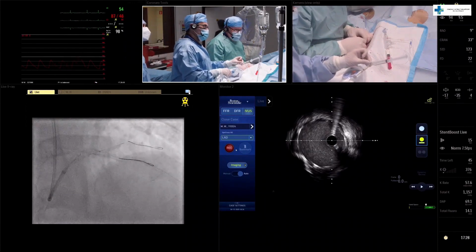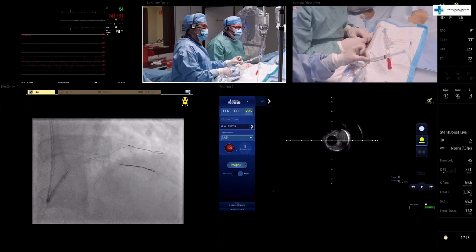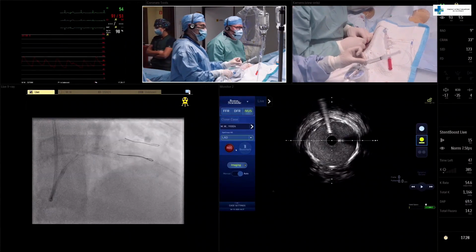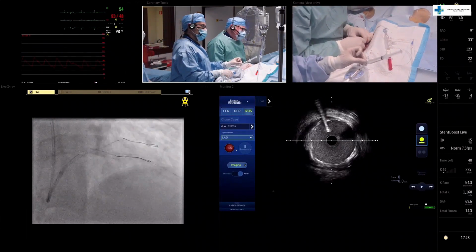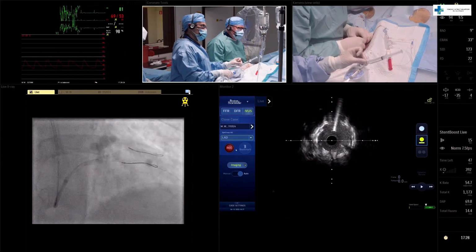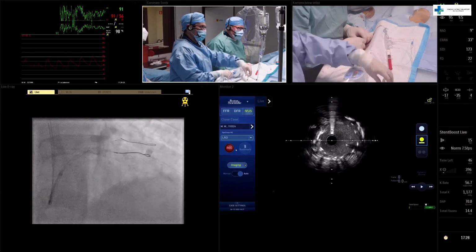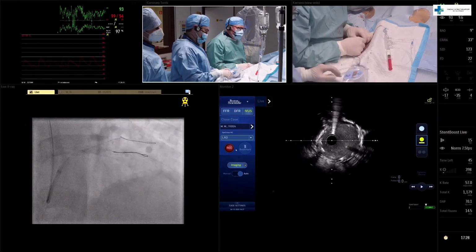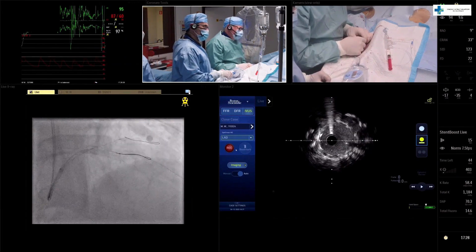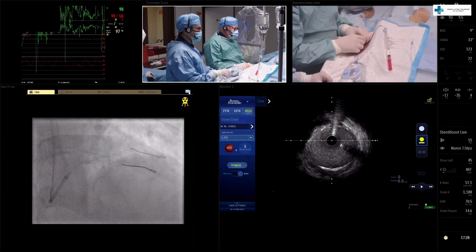This is protruding like we like, to cover all the stent, maybe 2 millimeters to the aorta, but we are going from the guiding directly to the left main, which is okay. And now you see the origin of the circumflex, which is patent. You see this calcium, which was cracked. So now we are really sure that we are going with our wire appropriately, and we can try to rewire.